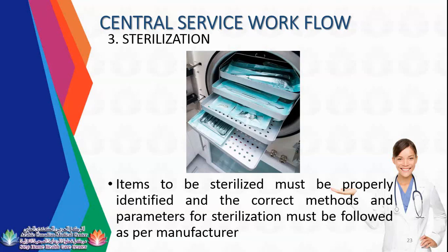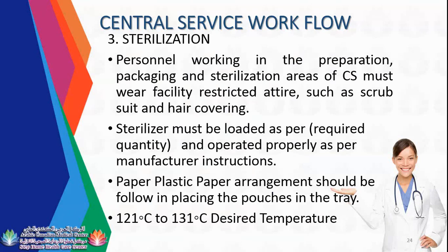Items to be sterilized must be properly identified, and the correct methods and parameters for sterilization must be followed as per manufacturer. Personnel working in the preparation and packaging area of CS must wear facility restricted attire such as scrub suit and hair covering. The sterilizer must be loaded as per required quantity and operated properly as per manufacturer instruction.